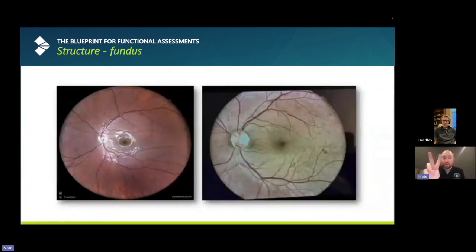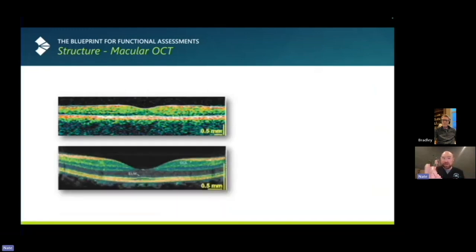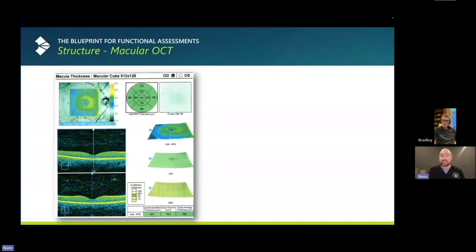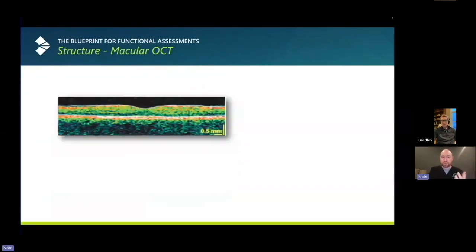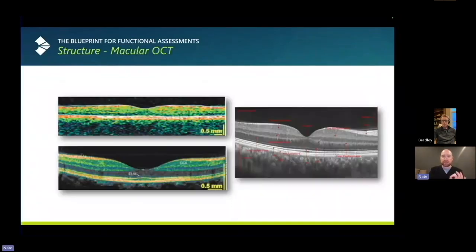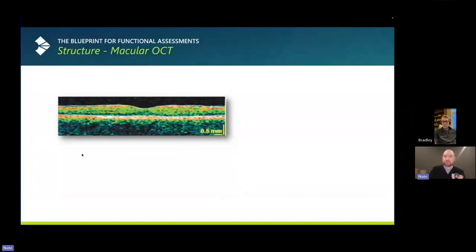You're going to take a wide field photo or some sort of photograph, and you're going to do one of these as well, which is an OCT technology. And we'll come back to this in just a second. My point is this: DFE, structure. Fundus photos, let's go back here, structure. And OCT looks at structure. If you're doing a DFE and taking a photo and looking at OCT, you're missing half of the picture. You're only looking at the structural tests, and you are not looking at function. So you want to look at both structure and function.